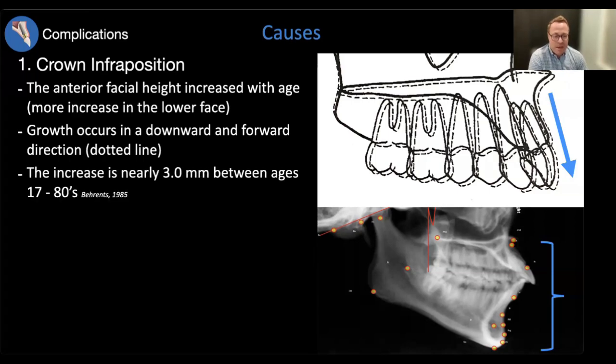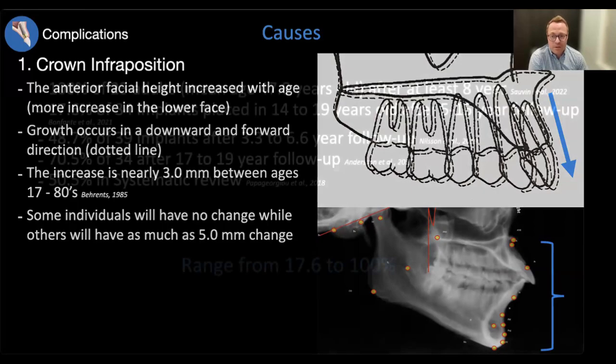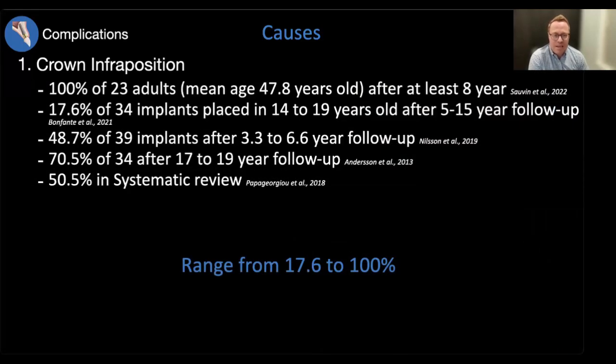And so for some that can be quite a bit, up to 3 millimeters. It's even been reported up to as much as 5 millimeters. So this can definitely be a challenge for us. Not always is it as extensive as I showed in that picture, but it can be. And here's an example of some of the articles that have discussed this. And of course, there's more than just this, but you can see this gives us a range.